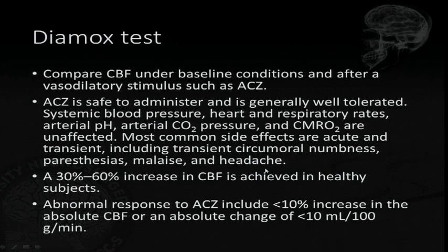You can call me whenever you get this order in. I'm tracking that patient that was ordered, so we'll see when it's scheduled, and we can do that in the MR the first time. But then the techs should know what to do. It's just the IV push of Diamox, and the patient will have to sit on the scanner for 10 or 15 minutes and then rescan again. And that's about it. Then you're just going to compare, and your Rapid will give you volumes, so you'll compare your volume before and your volume after, and see if there's an increase in blood flow.